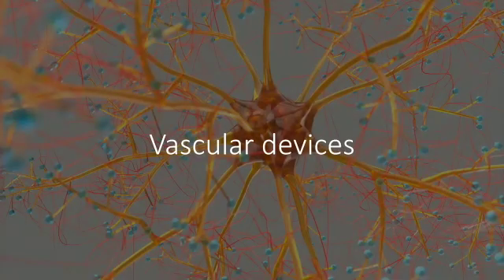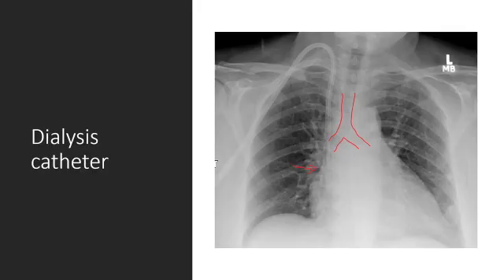Next, we're going to go over the most commonly used vascular devices. This image demonstrates a tunneled dialysis catheter, tunneled under the skin towards the internal jugular vein, heading caudad towards the cavoatrial junction. Most central venous catheters need to terminate at the cavoatrial junction. You may see a little bump where the SVC ends and the right atrium starts — that would be the cavoatrial junction.